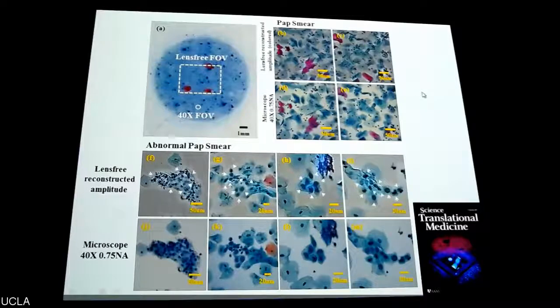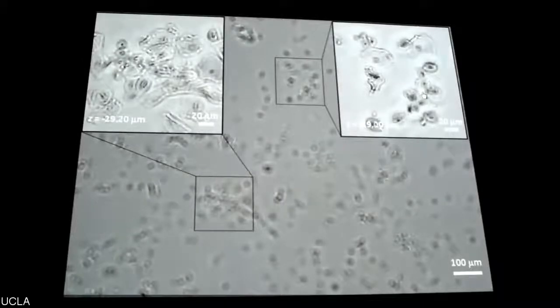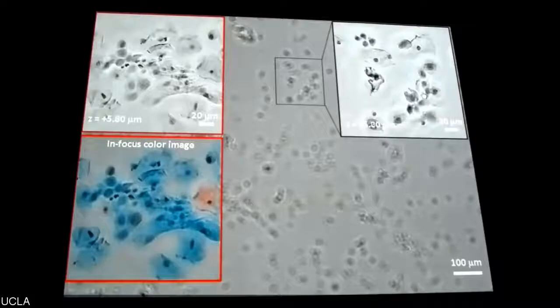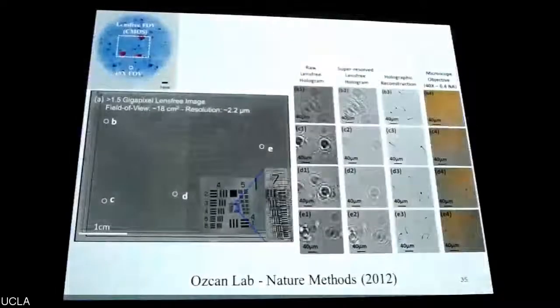One important advantage here is the 3D nature of our reconstructions. As shown in this movie, you can capture these images and store them in a server. And a pathologist, maybe a few hundred kilometers away from the patient, can log in to the server and on demand look into different sections and physically move in depth within the sample, which is very important. It's giving the physical depth of field knob to the microscopist, which is very important over large fields of view. This is also a PAP smear sample that is being reconstructed.